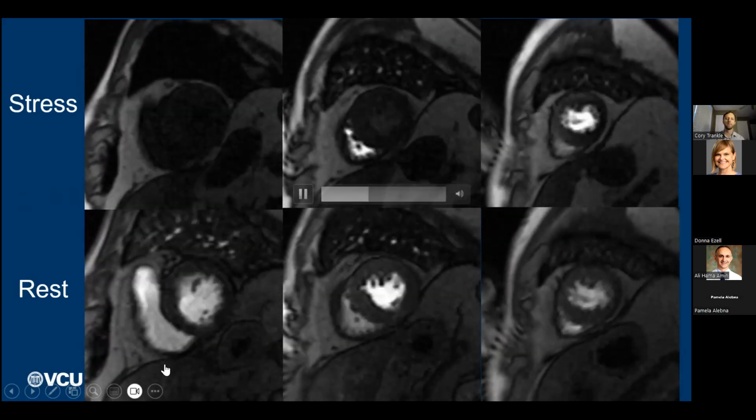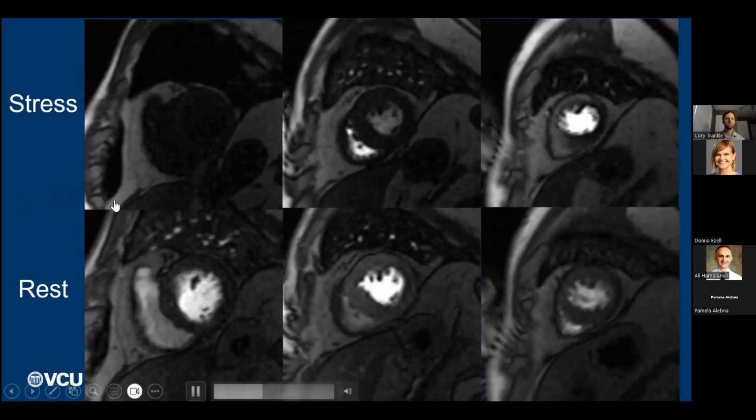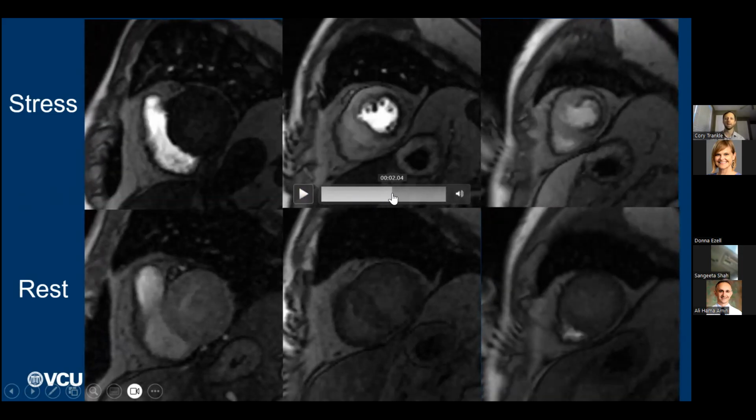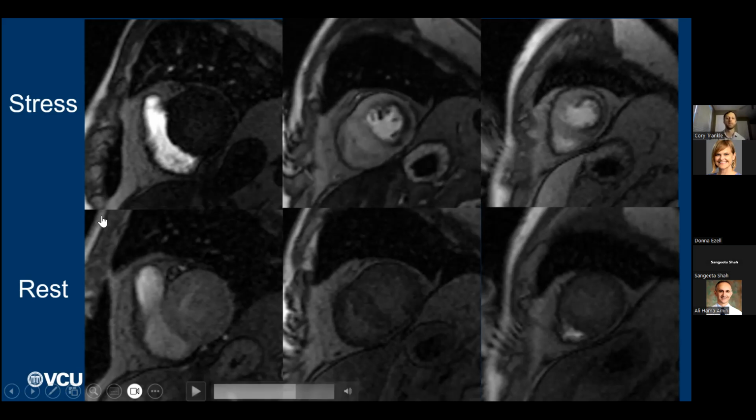And so there are a few things that I'm gonna, let me see if I can pause all these. So there are a few things that make these pretty typical for a real perfusion defect as opposed to sort of a fake out. We have some artifacts like dark rim artifacts that can sort of trip us up sometimes. This defect lasts more than 10 beats, 10 cardiac cycles. It affects more than 1/3 of the thickness of the myocardium. If you look, the darkest portions are along the endocardial surface, and as you move out to the epicardial surface, there's sort of a gradient.